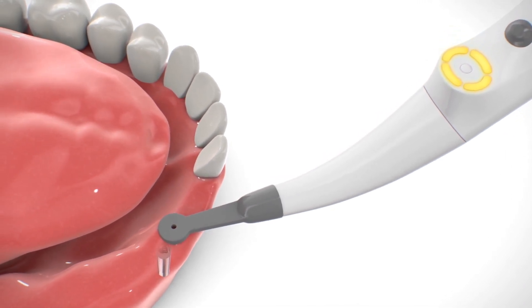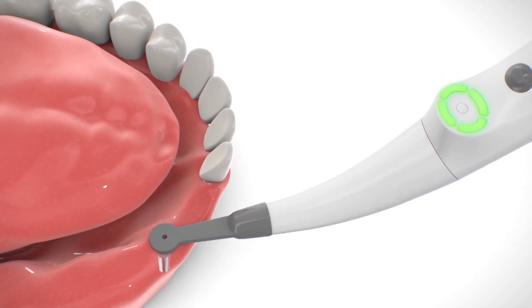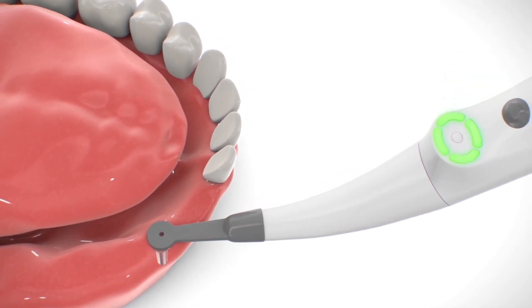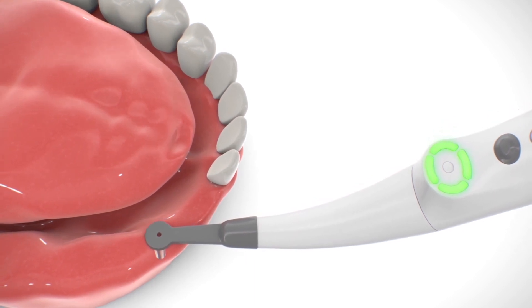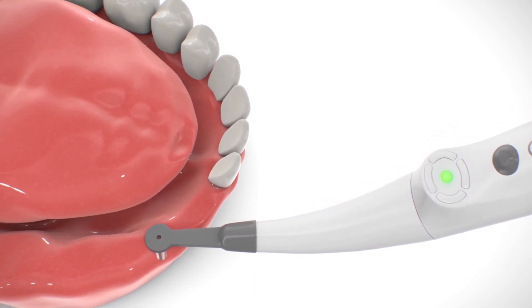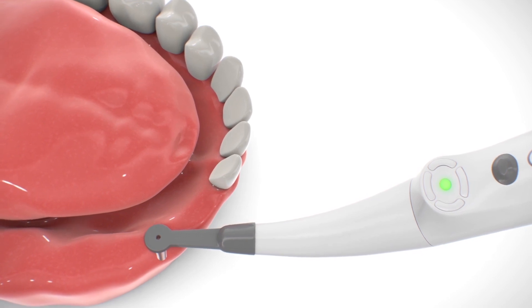Reverse direction and slowly move the sensor back. Four segments turn green again. Continue smooth sensor movement without stopping until the central dot turns green, indicating detection of implant location.